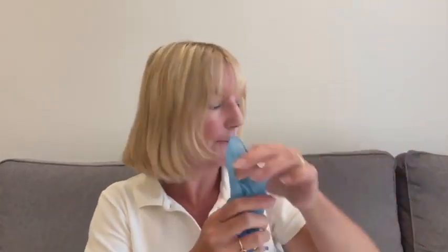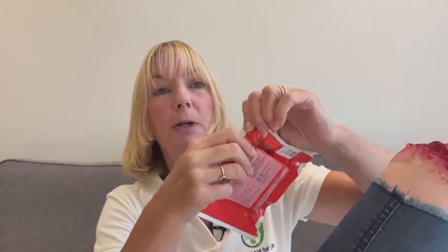Other really important thing, put on gloves. There will be gloves in your bleed kit. Put your gloves on. Blood is not nice, and it can lead to infection. Put on your gloves and stop that bleeding fast. So you put on your glove, you stick your finger in and you find the source of the bleeding. You grab your gauze, you rip it open, and inside you are likely to find that it is Z-folded up like that. So it is Z-folded gauze. That is the easiest to use, and most of them are folded like that.